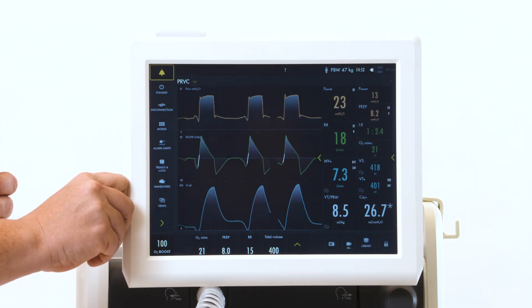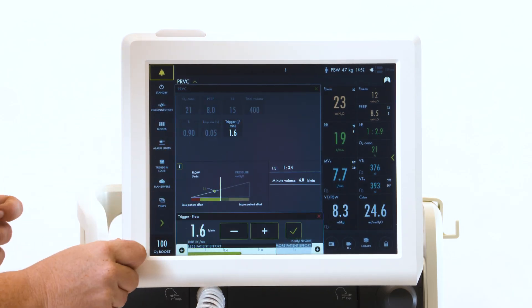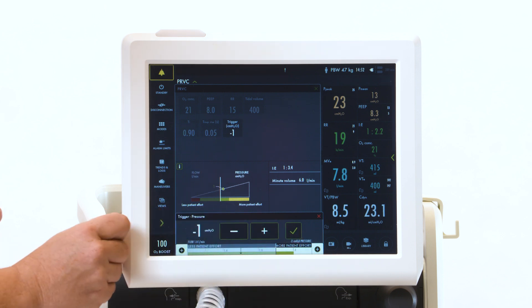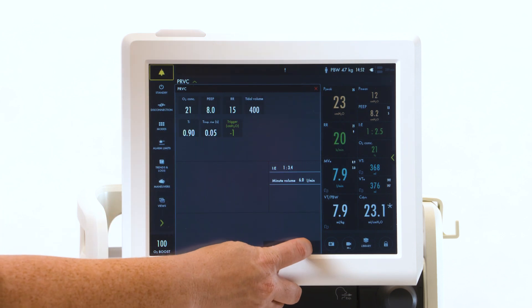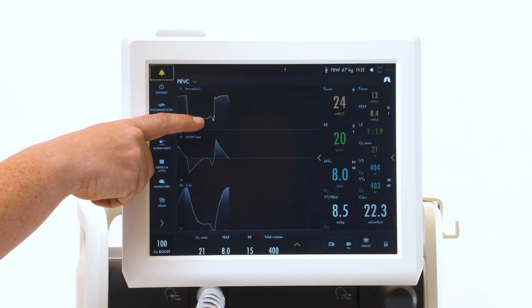If you would like to change to a pressure trigger, go to your mode and to your trigger setting. Here, you can then slide over to the pressure side indicating more patient effort and check mark to confirm. Now, you will see the deflection on the pressure scaler.